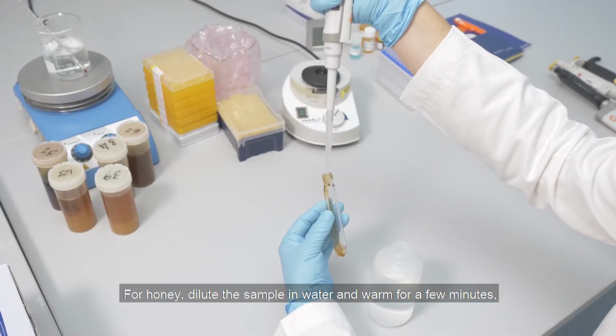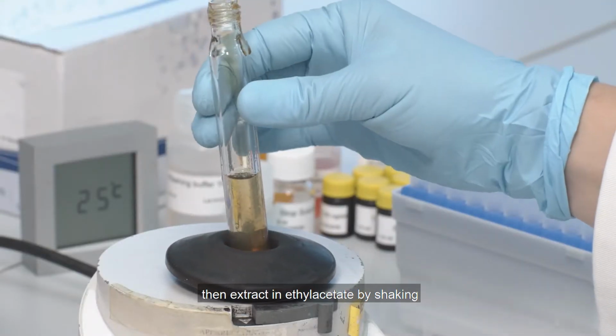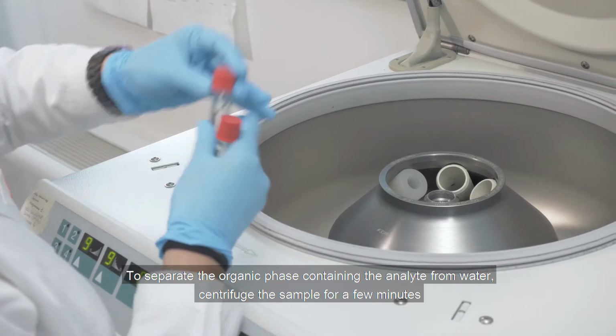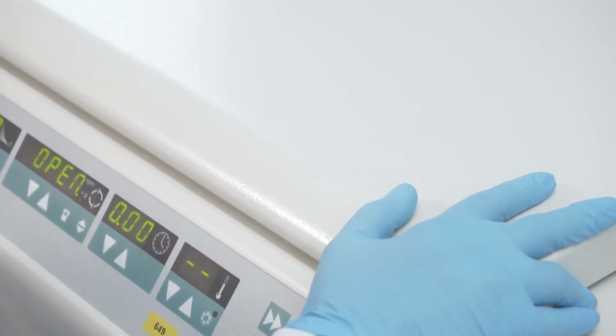For honey, dilute the sample in water and warm for a few minutes. Then extract in ethyl acetate by shaking. To separate the organic phase containing the analyte from water, centrifuge the sample for a few minutes.